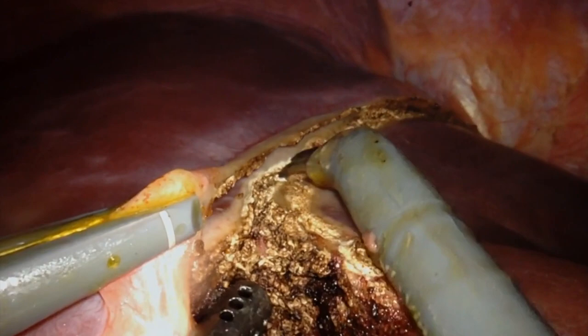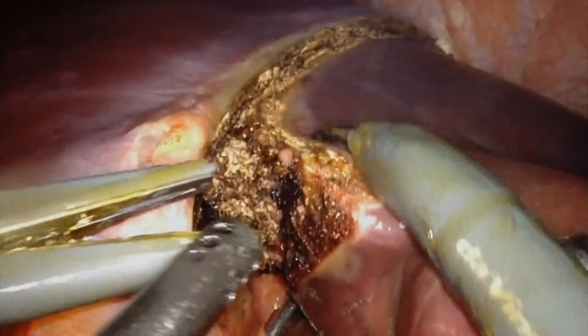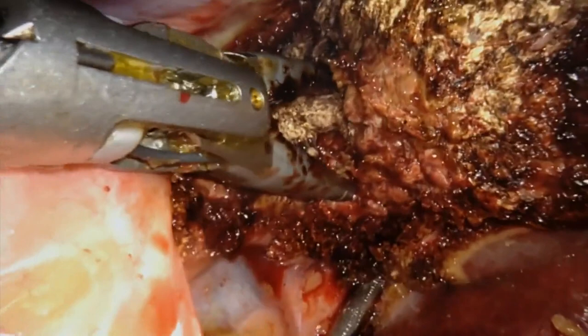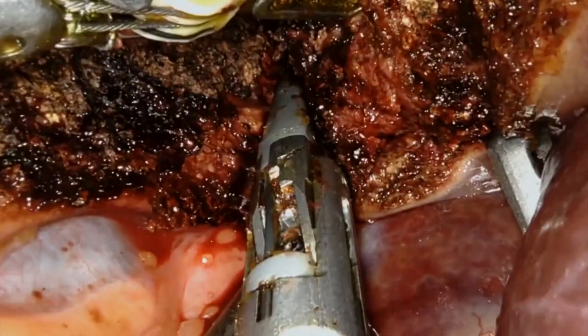The superficial transection was begun with the monopolar scissor cautery. The assistant at the bedside held the laparoscopic suction for smoke evacuation as well as blood from the liver parenchymal surface. We utilized an extended vessel sealer to divide the deeper liver parenchyma with careful attention to crossing vascular branches, inserting the vessel sealer carefully while paying attention to resistance, to avoid bleeding or injuring crossing vascular branches.